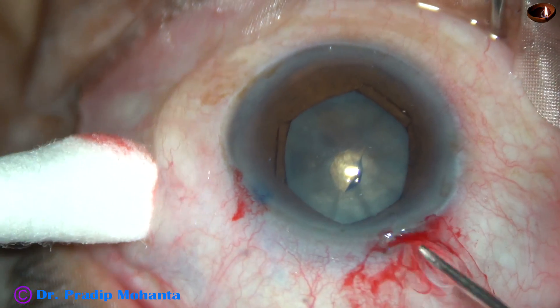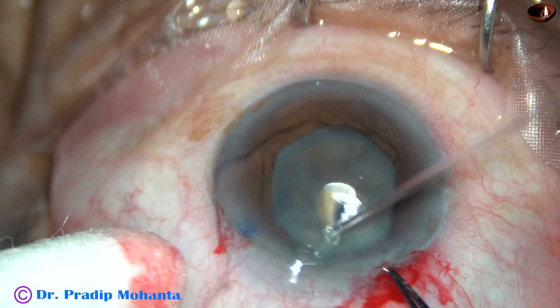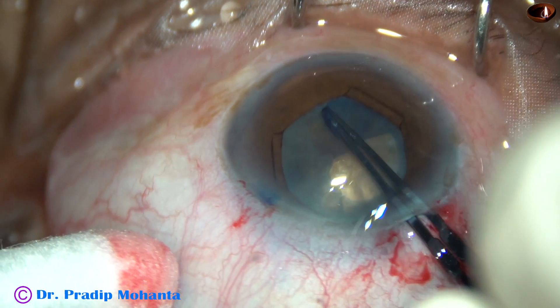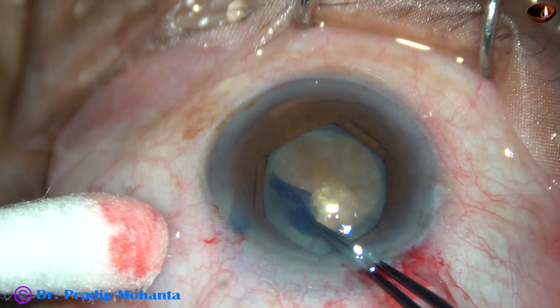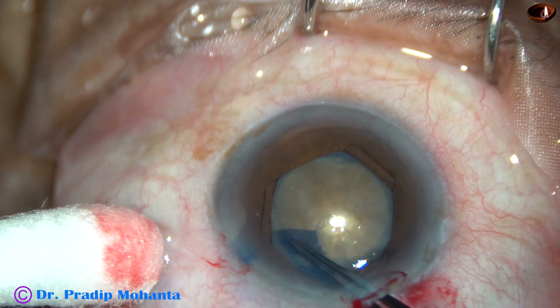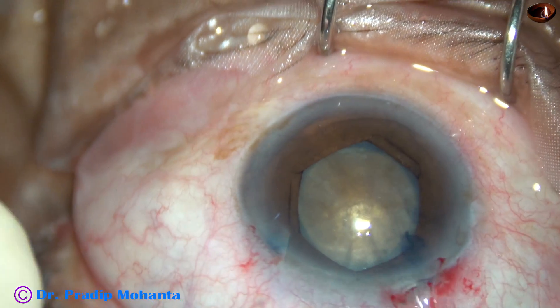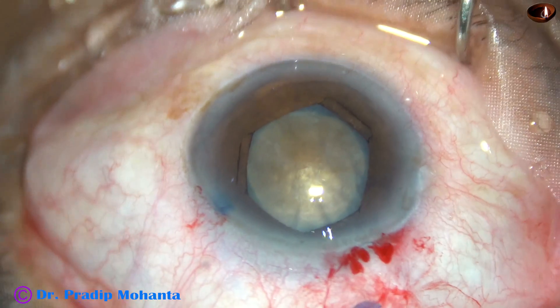And now capsulorhexis is to be done. I have incised and raised a capsular tag with a needle. And now I am going to use utrata forceps — hold the capsular tag and go along the margin of the hexagonal pupil. It has been made hexagonal by the hexagonal pupil expansion device, and an adequate size hexagonal rhexis has been done.